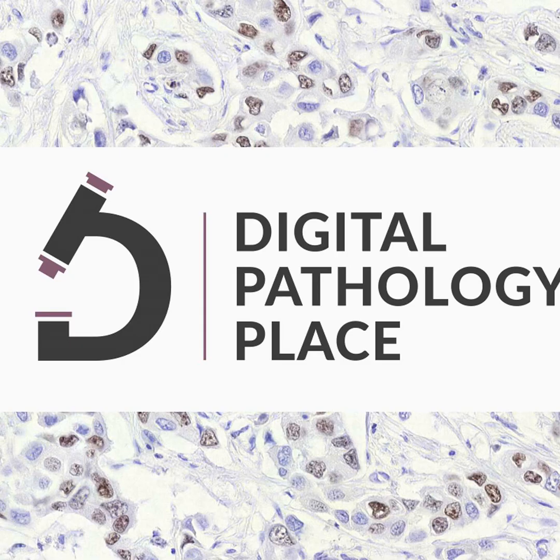For example, panoptic segmentation is a newer approach that classifies and segments each pixel regardless of the chosen class. However, this approach can be computationally expensive and very time-consuming and may not always be necessary. By selecting the most efficient and appropriate approach, we can save both time and computational power. As computational power is still a finite resource and expensive, it is crucial to choose the correct approach to manage costs and ensure timely analysis of pathology images. Understanding the different computer vision approaches and how they match our pathology image analysis needs can help us make informed decisions in selecting the most effective and efficient approach.